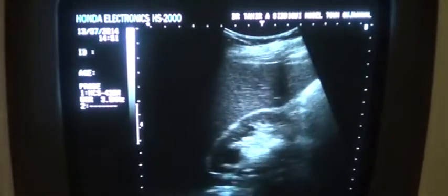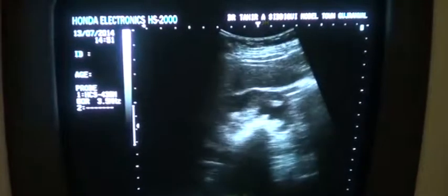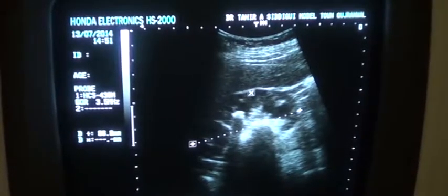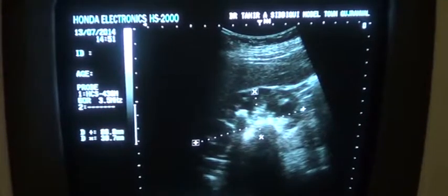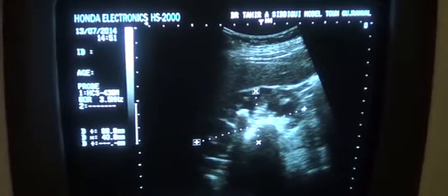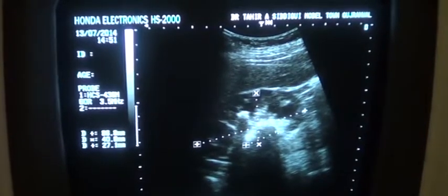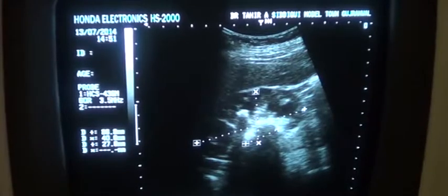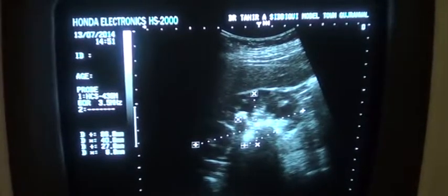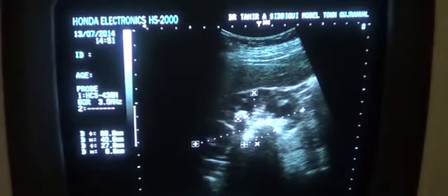Now this is the kidney in total. What are we seeing? We see that the kidney measures approximately 8.6 centimeters in length and 4.0 centimeters in anterior-posterior diameter. This half moon-shaped area, curved, echogenic, giving a very sharp posterior shadow, is a calculus impacted in the pelvic region of the non-dilated pelvis. And the rest, this is a calcification, another calcification, this one, measuring 6.8. And the one in the pelvic region measures 2.76 centimeters, a very large calculus.